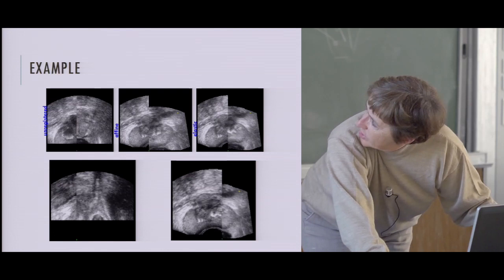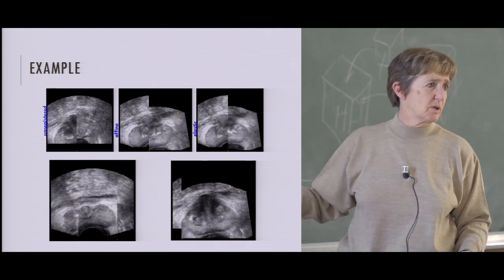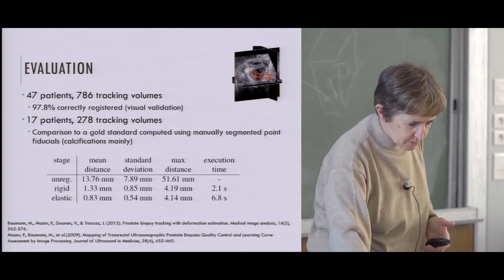And after registration, you have determined this function that allows to map one volume to the other, and you see that there is an almost perfect correspondence between the two volumes. And what is interesting is that it is totally automatic and with no real intervention of the clinician to get the results.